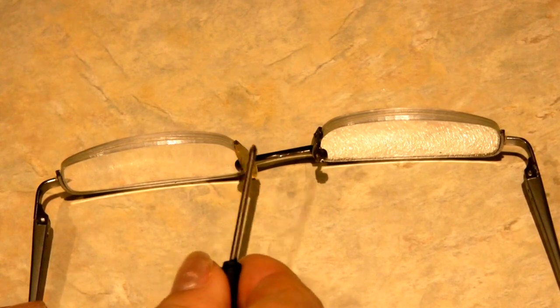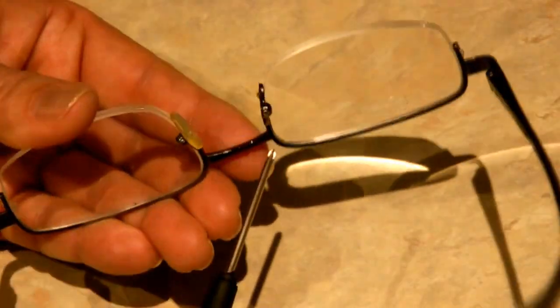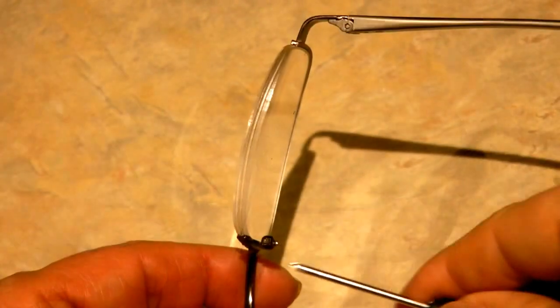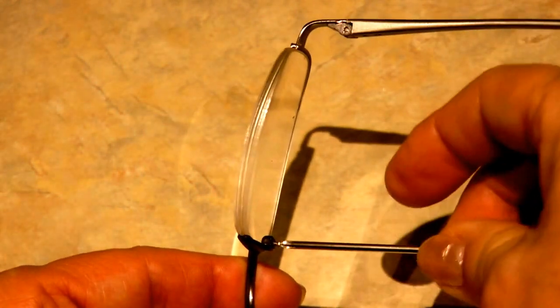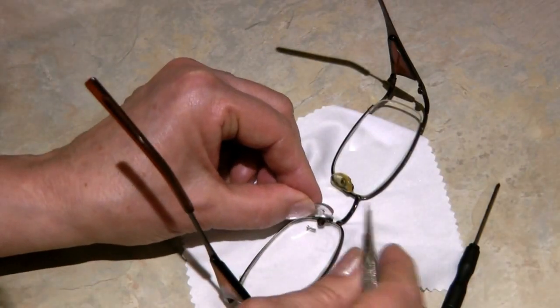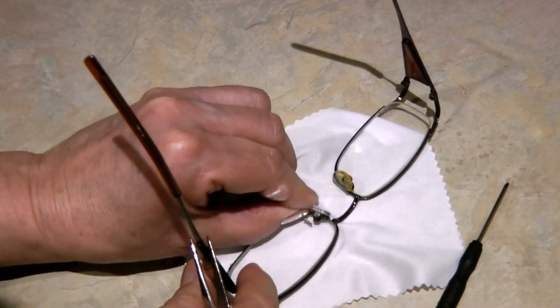Take the little tiny screwdriver and remove the screw — turn it to the left until it comes out. Now the damaged nose pad, the little bit that's left, will pop out. Keep track of your little screw. Now take your new nose pad and insert it into that little hole.